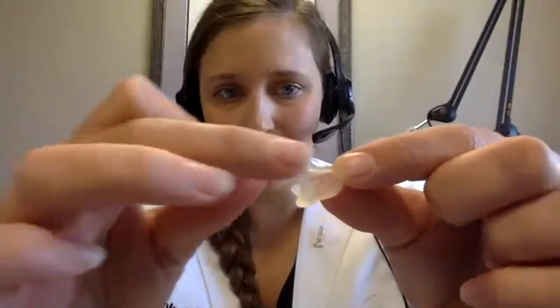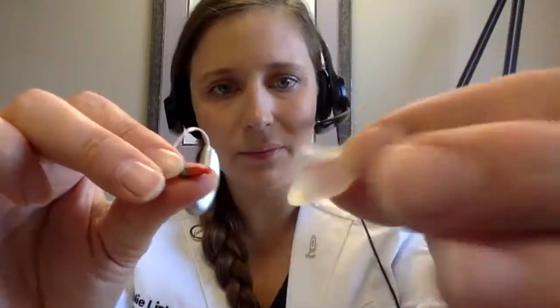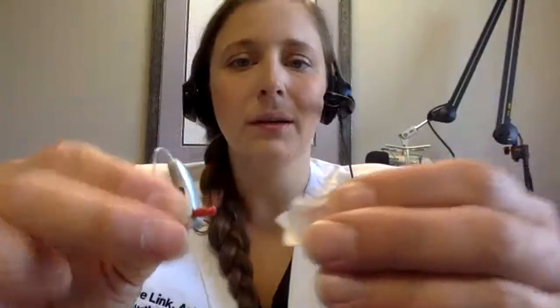Once we need to put it back on, generally speaking, you'll have some kind of print on the front. The front is going to be facing away from you when you put this back in. So you want the little sprout to go up. If you can see the wire kind of coming up, just like it would sit on my ear, it's going to come right in through here, just like that. All right.